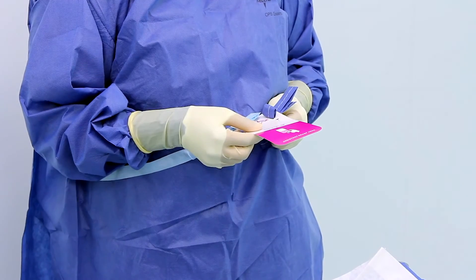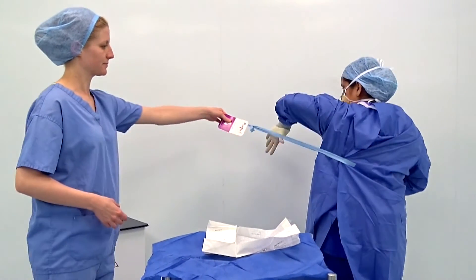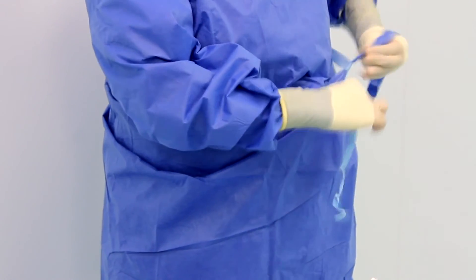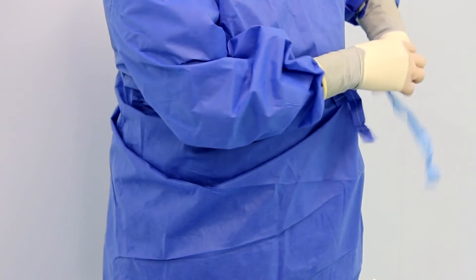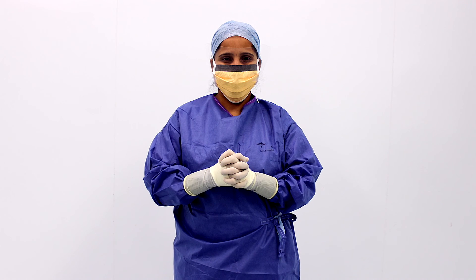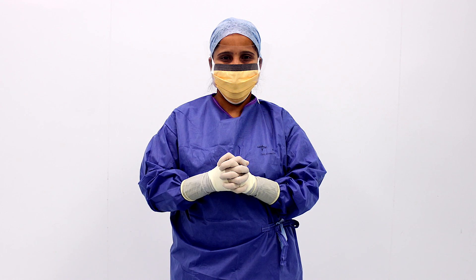Lastly, we then pass the sterile tab of the gown to our assistant, who holds it in place. Whilst we rotate anti-clockwise, we then take the tie back and perform a simple bow to help secure the gown. Remember that as we are now sterile, it's advised that we rest our hands upon a sterile trolley, or keep our hands together above the level of the elbows and with our elbows tucked into our sides. This minimizes the risk of us accidentally touching anything non-sterile and becoming desterilized before we enter the sterile operating field.